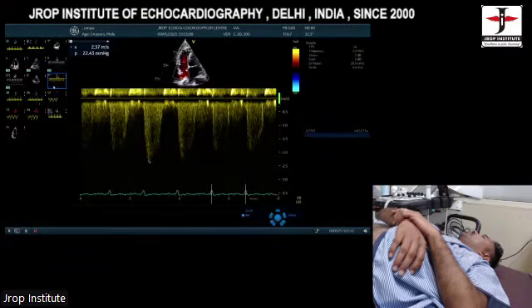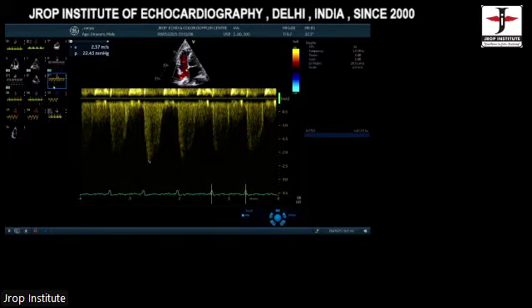I'll give you an answer for this, very simple. Where do we dilate when we grow? At the center actually, sir. Tummy, yes, sir. So in normal cases, the LV will not be dilated in the mid segments. Whenever the LV dilates, it always dilates in the mid segments. So what we do is, we are not dependent on the LV in the mid segment. We are dependent on the LV in the basal segments, because the base is there, the apex is fixed. The base moves toward the apex. So we always do a measurement at the level of the base. Okay.